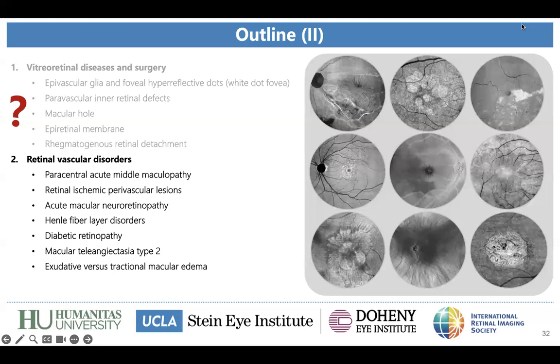images. My question to you is, do you use any OCTA segmentation? Do you prefer any segmentation in your practice? Is there any segmentation for a specific disease that you think is best to use in daily practice?